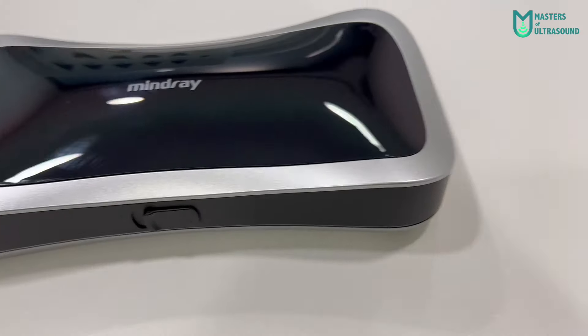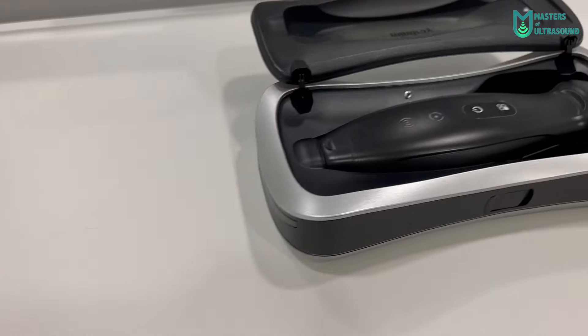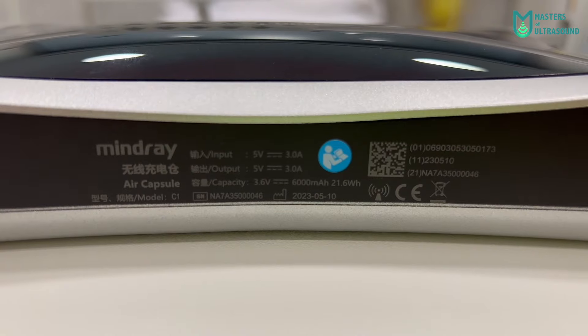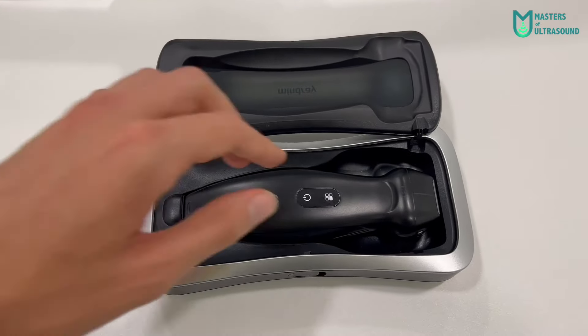We will start with the outside. Here you can see the protective case and inside the probe. This is one of the three probes Mindray has released — the phased array, specially designed for cardiac exam.